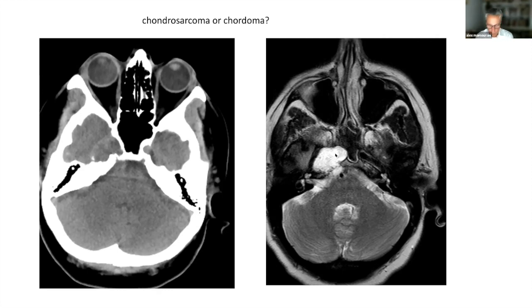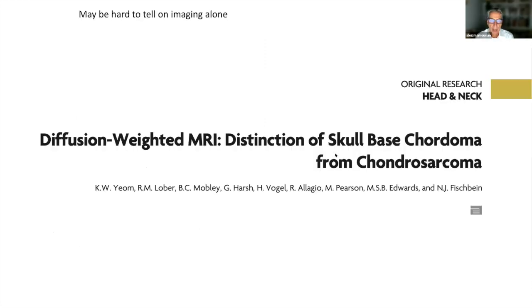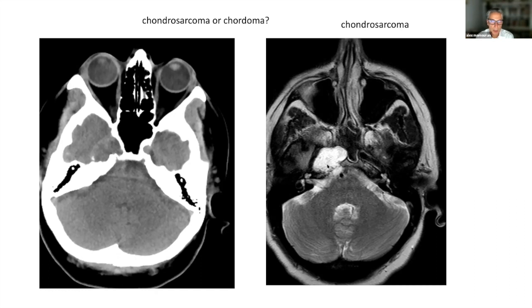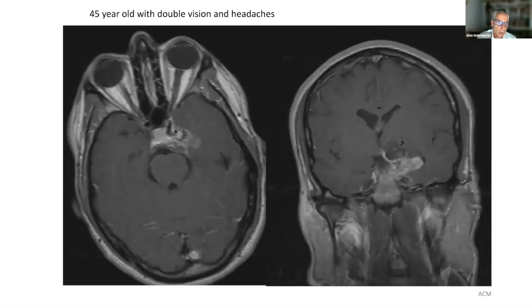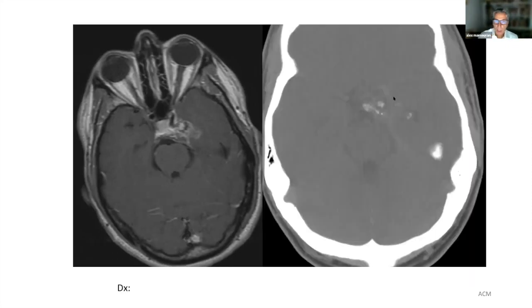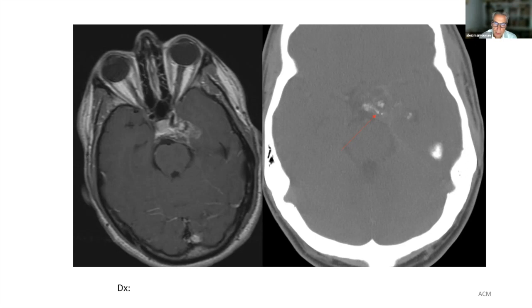This off-midline case with T2 prolongation proved to be a chondrosarcoma. These are often difficult to distinguish from chordomas. Some people say diffusion-weighted imaging can help. Here is a clival-based mass extending into the middle fossa. The reason to show this is it has what some call ringlet-like calcifications. Whenever you see amorphous calcifications in a clival mass, you should be thinking more of chondrosarcoma than chordoma — intrinsic calcifications are much less common in chordoma.